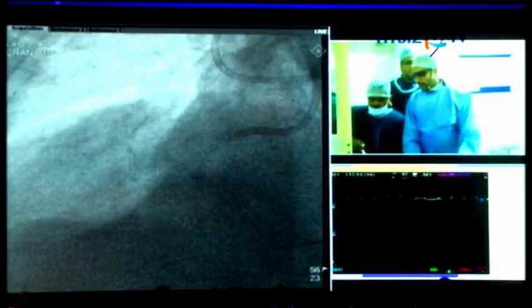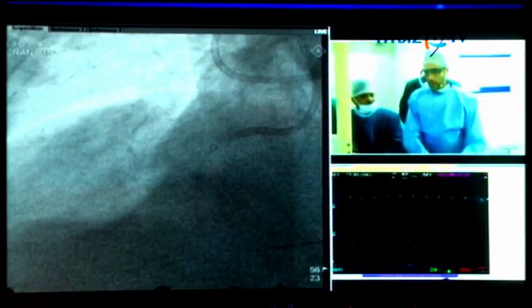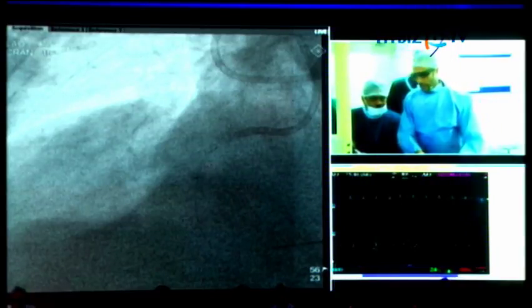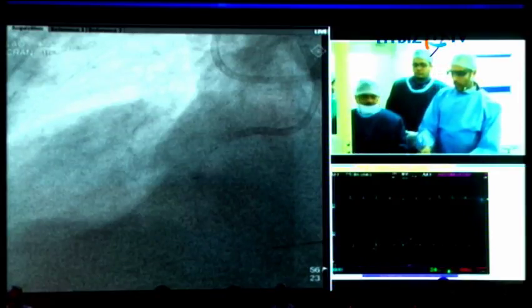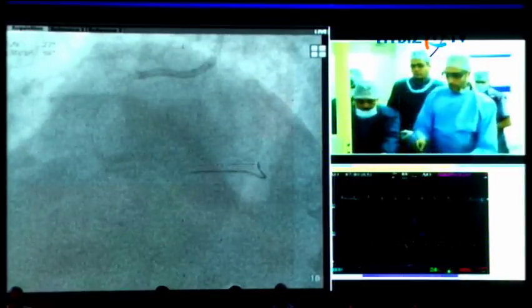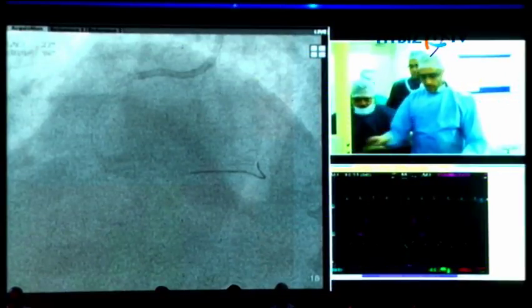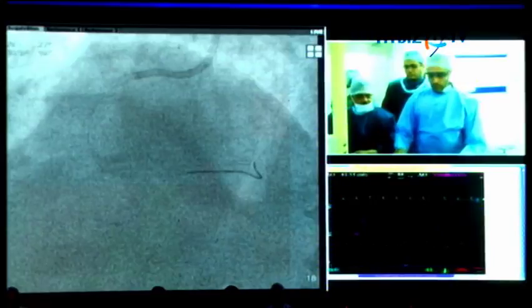I think that's an excellent point if you are subintimal. Okay, center it. If neither works and we are truly subintimal, let us say ADR didn't work and my retrograde doesn't work, then you definitely don't want to stent long areas, especially after you have knuckled in.